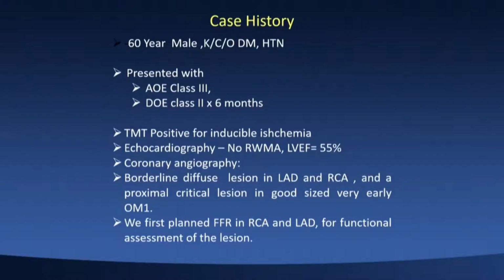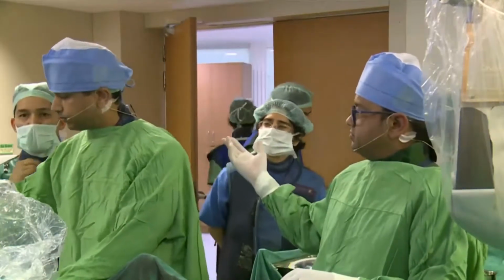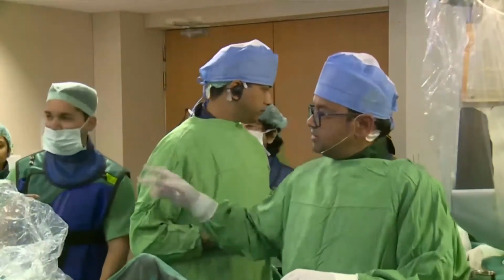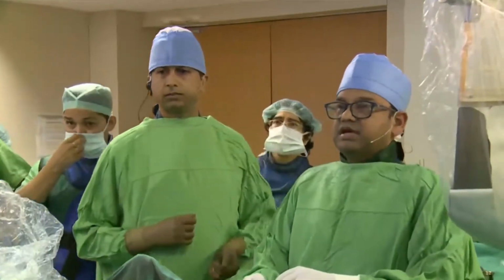We'll introduce the team here. To my right is Dr. Vivek. Hello. And he'll be assisting me in the case. Vikram, he is our technical expert. Dr. Kavita, who is with me, and my OCT team is there. So we have a case.